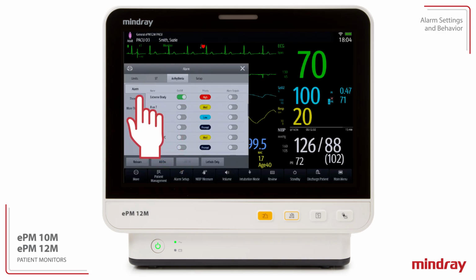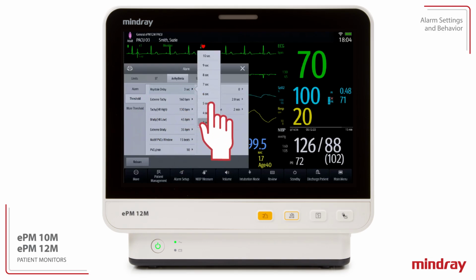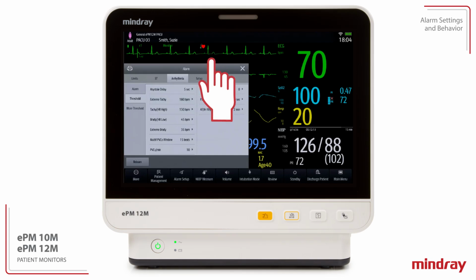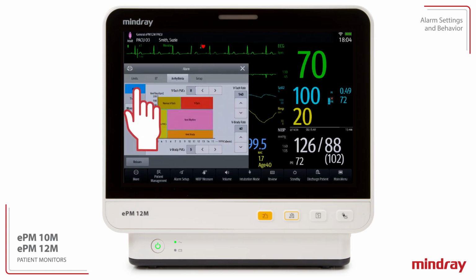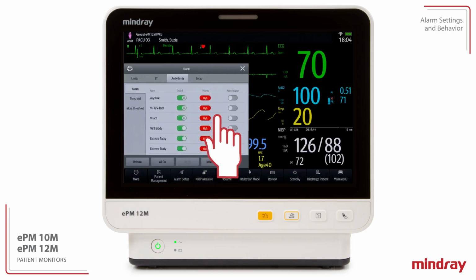Select Threshold in the Arrhythmia tab to adjust advanced arrhythmia settings. Select More Threshold in the Arrhythmia tab to adjust ventricular rate and PVC threshold for VTAC and other ventricular arrhythmias. If configured, enable the Alarm Output switch to automatically print the selected alarm to the integrated recorder or designated printer.